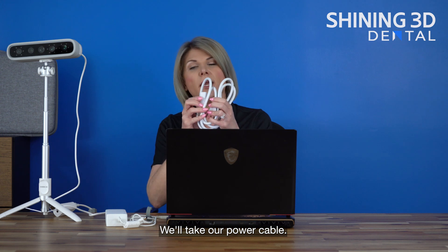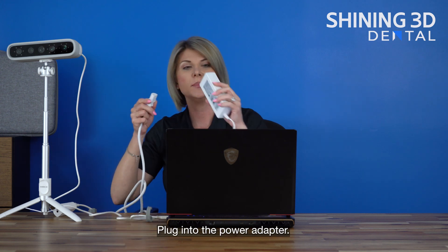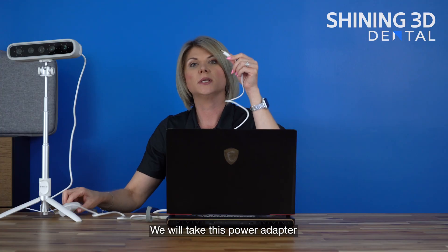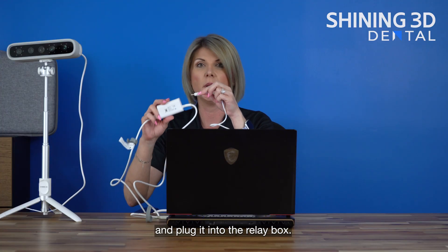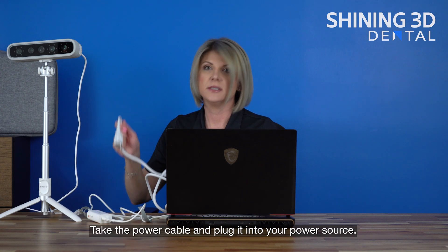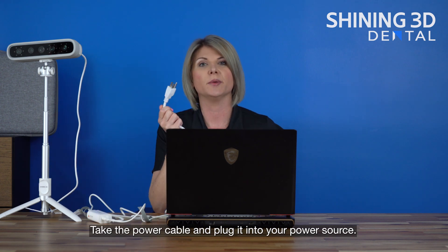We'll take our power cable and plug it into the power adapter. We will take this power adapter and plug it into the relay box. Then take the power cable and plug it into your power source.